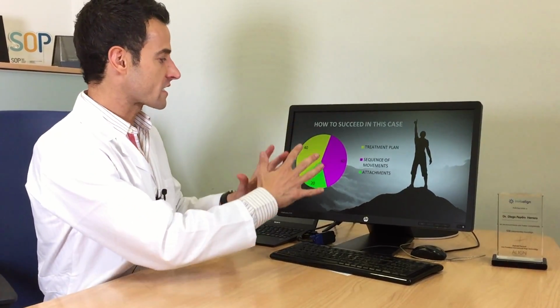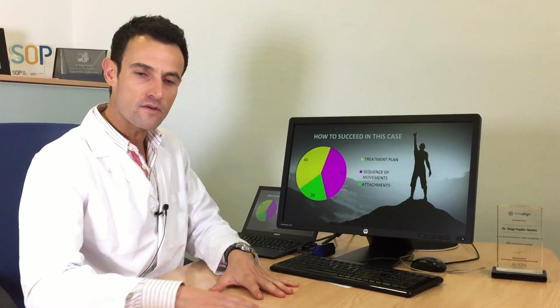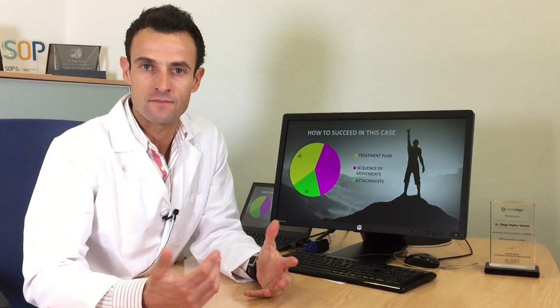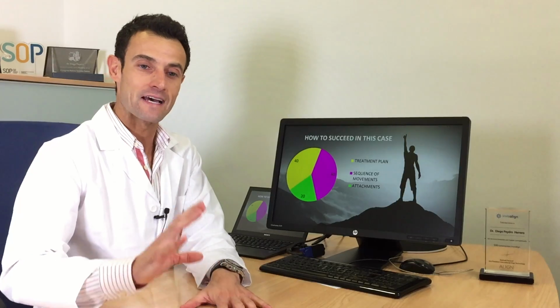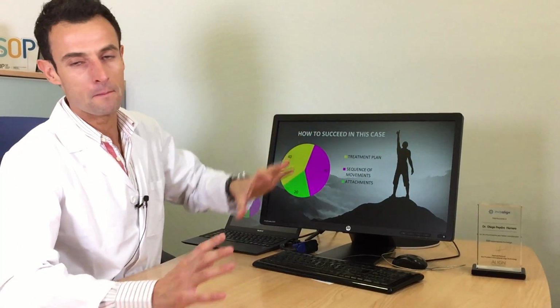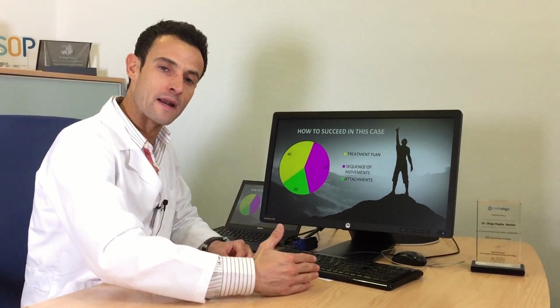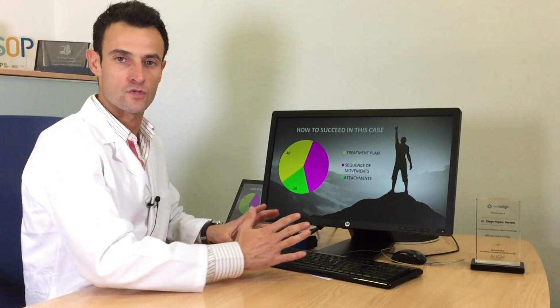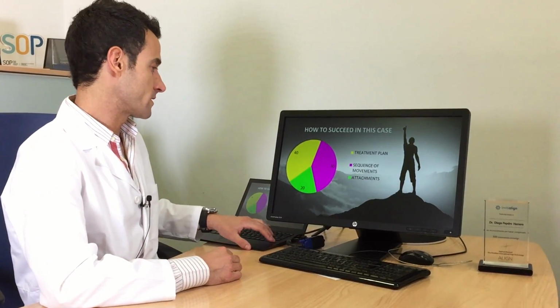For me to succeed in this case, the most important are not the attachments. Many of the questions that most of the doctors ask me is, Dr. Diego, what attachment do I have to use here or here? As I always tell you, the attachments are the least important. The most important is the treatment plan, of course, first, and then the predictable sequence of movements that I have to plan in the ClinCheck to obtain this result. This is the most important. At the end, the attachments.